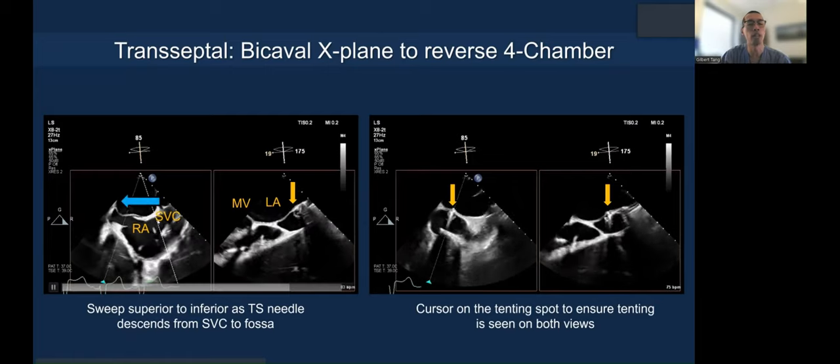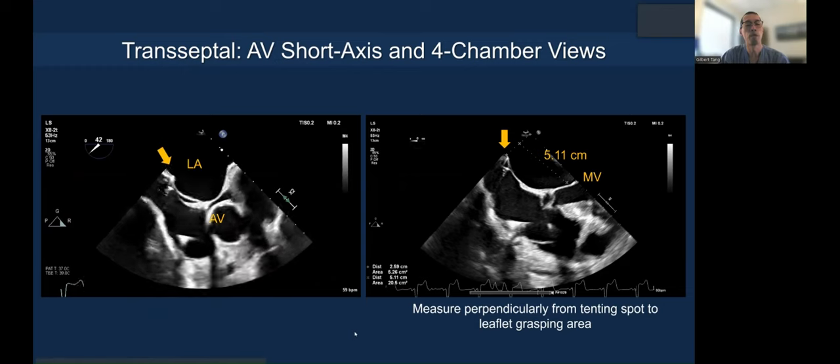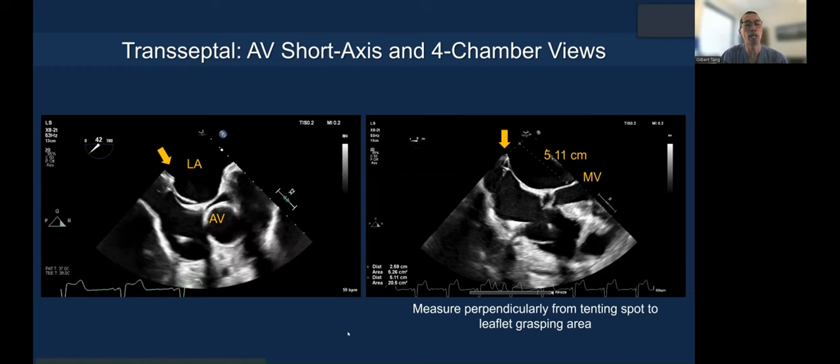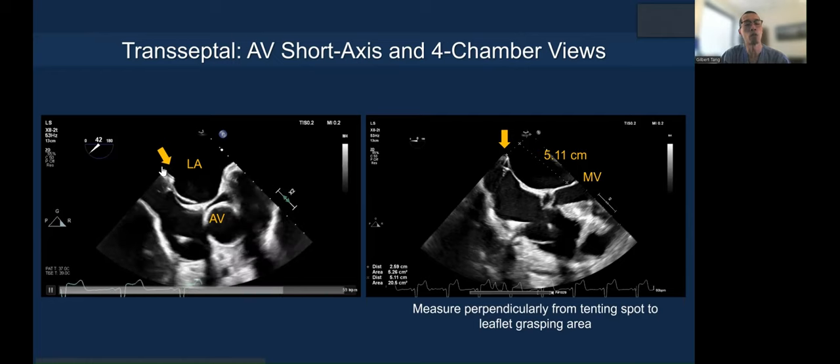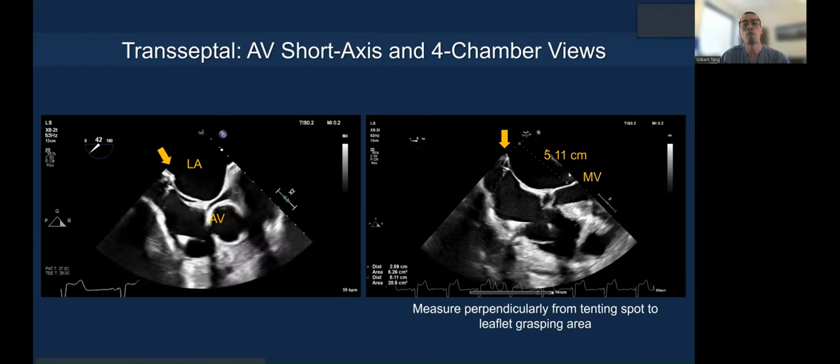You can see how you sweep to the aortic valve short axis and then the four-chamber view. The aortic valve short axis shows how posterior you are at the tenting site, and the four-chamber view measures the height from the tenting — draw a perpendicular line down to the mitral annulus where your grasping location is.